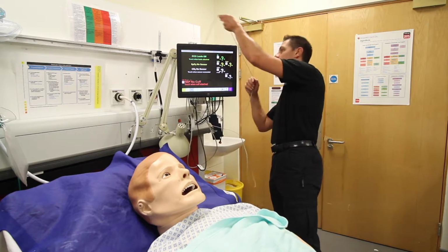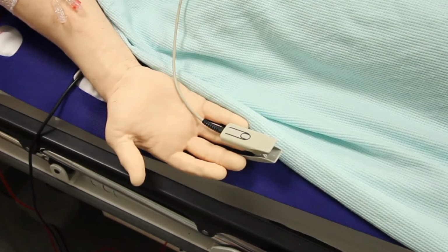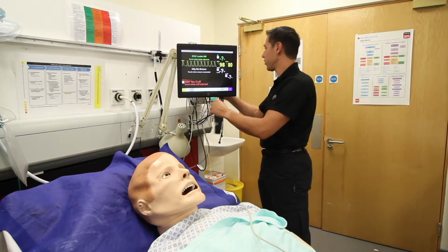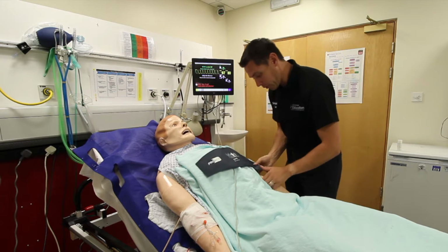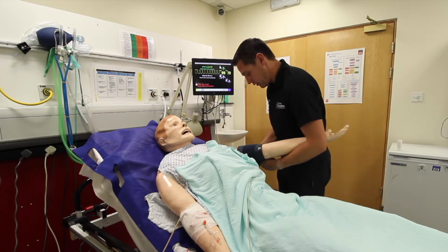So I'm just going to pop the sats probe on. So I find the sats probe on here, and then I'll pop it on his finger. The sats will start to come up on the screen there. You can see that he's got saturations of 97, so that's good. Then I'm just going to apply his blood pressure cuff. Just going to put this cuff on your arm, Brian. So he's going to get a bit tight. So just pop it on your arm there, as you would do normally. It ties up around there.